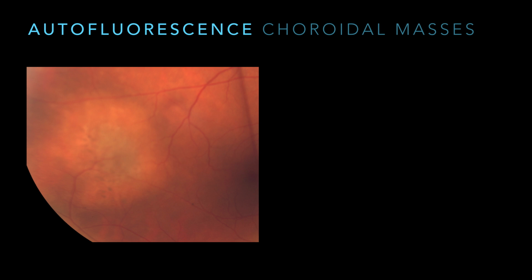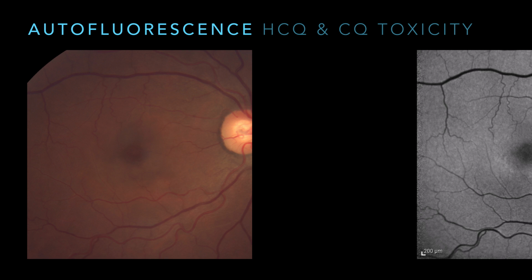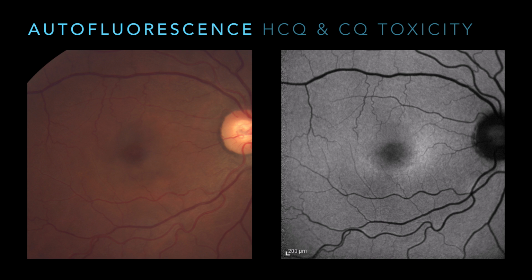Dr. Masson, just a quick question. We're always talking, especially in our clinic, about how you can use SD-OCT versus multifocal versus FAF to document toxicity. If you had to grade which one was the most sensitive or picked up changes earlier versus the one that was least sensitive? That's a great question. So what's the most sensitive or least sensitive specific for screening?